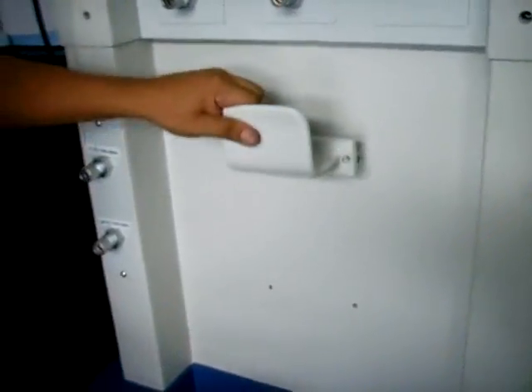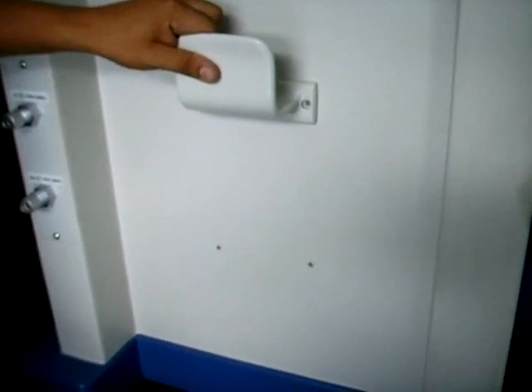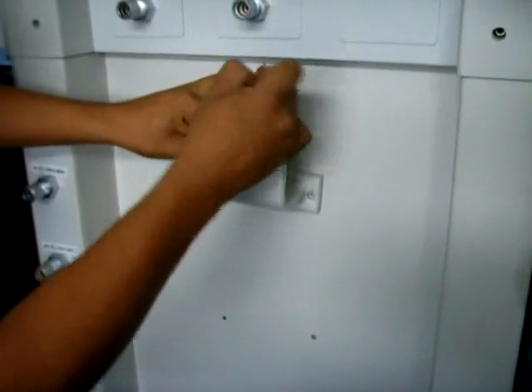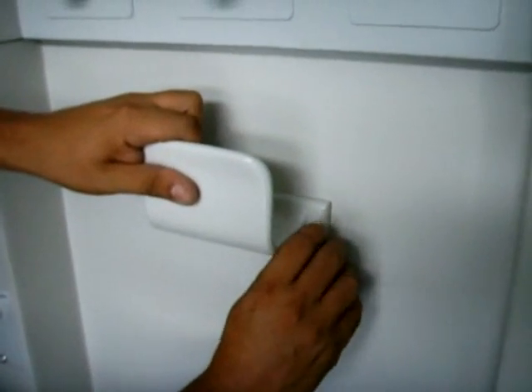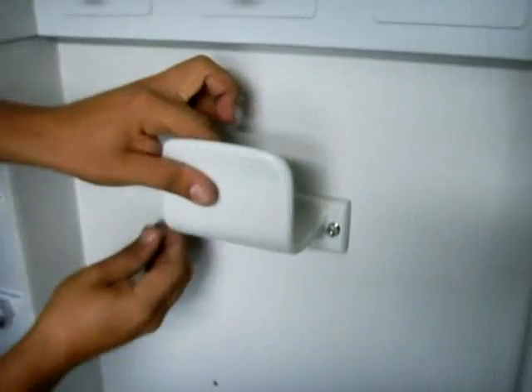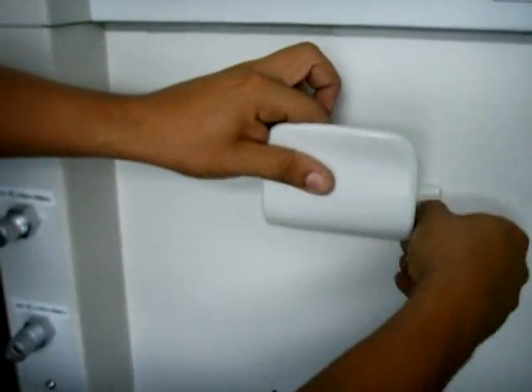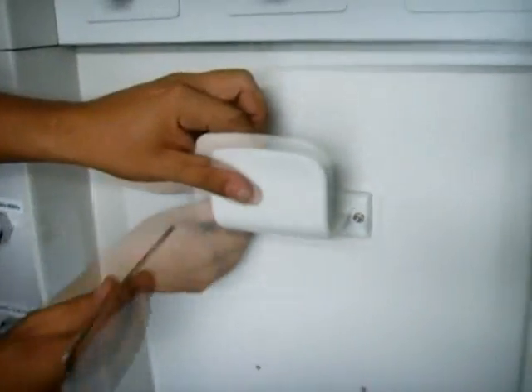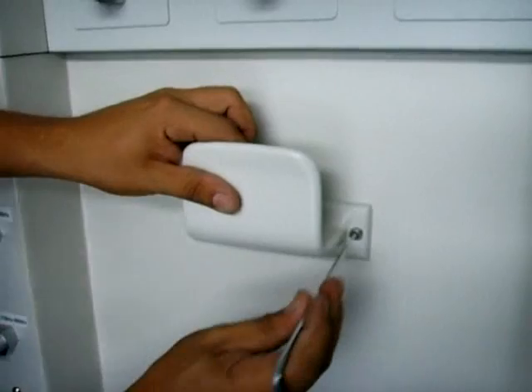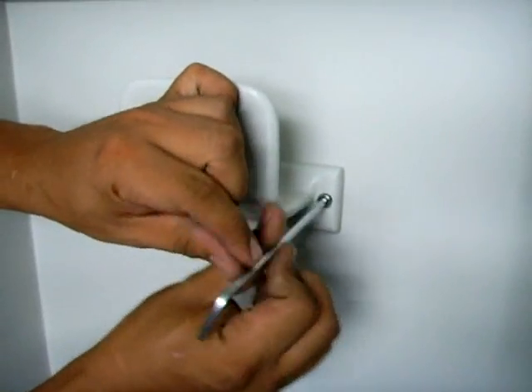Procedemos a realizar la instalación de los soportes de manguera, cada uno como se observa en el video. Tomamos los tornillos y ubicamos el lugar donde vamos a asegurar cada uno de los soportes de las mangueras. Una vez ubiquemos el soporte, procedemos entonces a realizar los ajustes con la llave Allen que trae el equipo consigo.